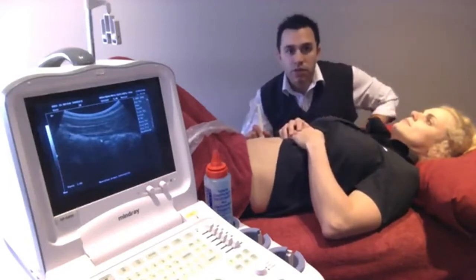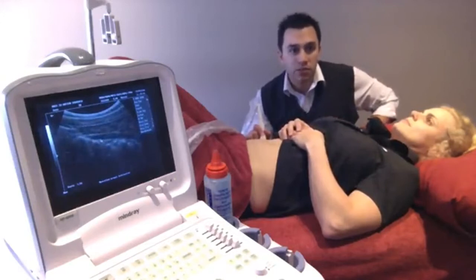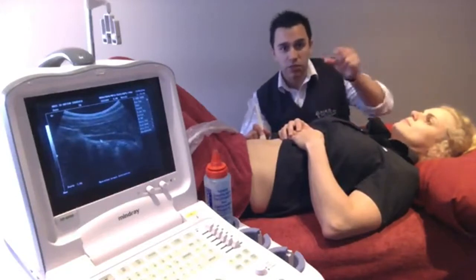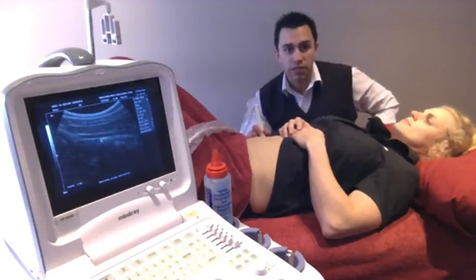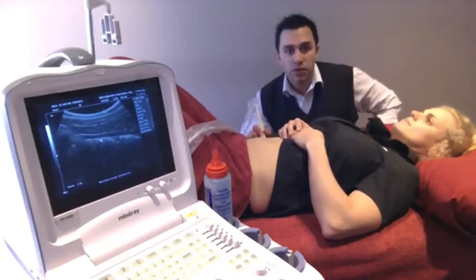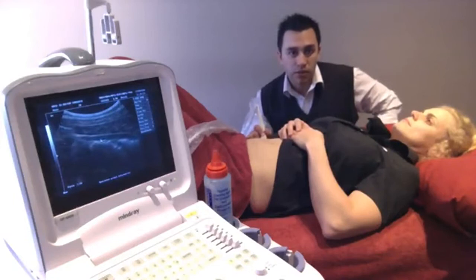Just drawing on nice and slow, and a little bit more. Good, hold that there. So you'll just see there that the transverse abs kind of fattens up like a sausage does — it shortens and widens. And relax. We're going to try and hold one for 10 seconds. Just drawing on nice and slow, a little bit more. Good, hold that there. One, two, three. Not too bad, not too bad. Great, and relax.